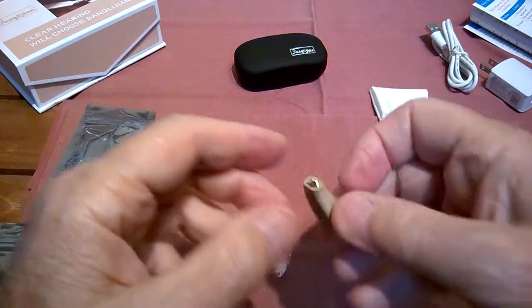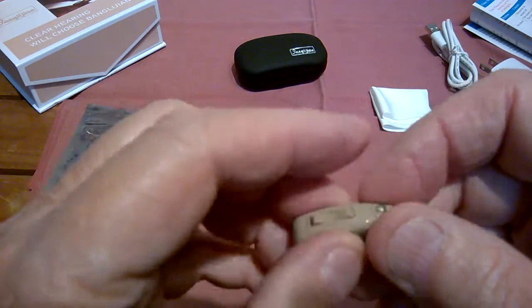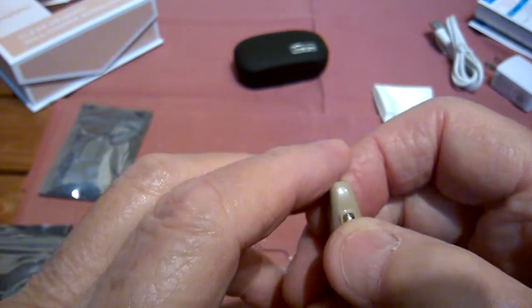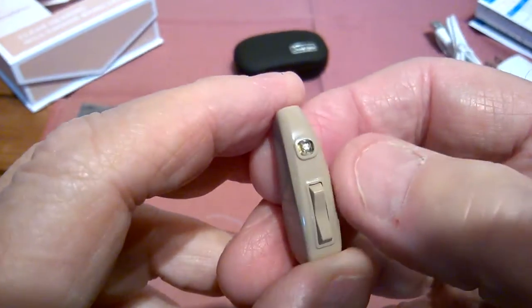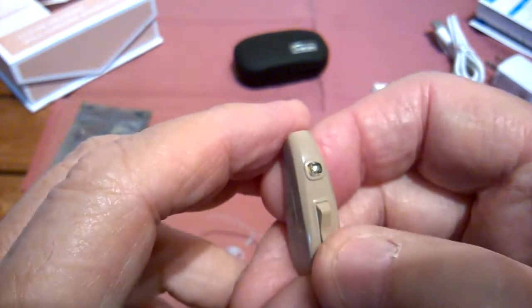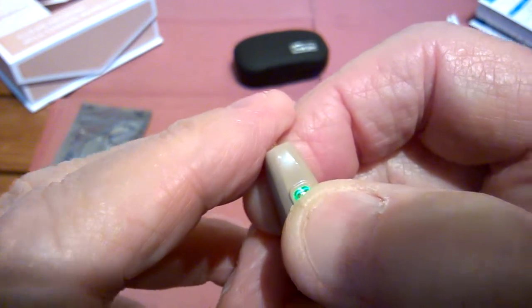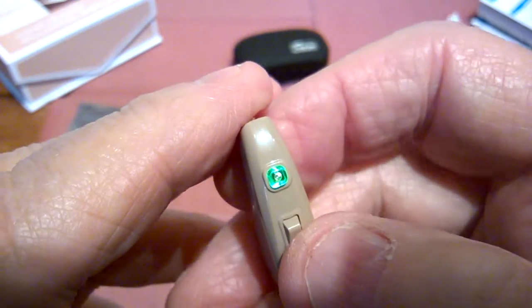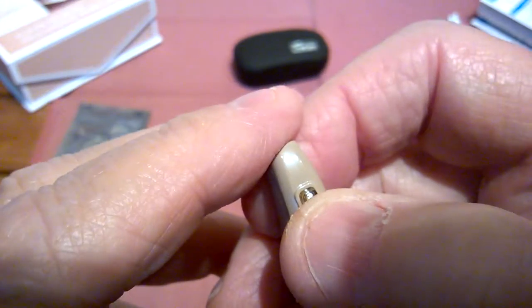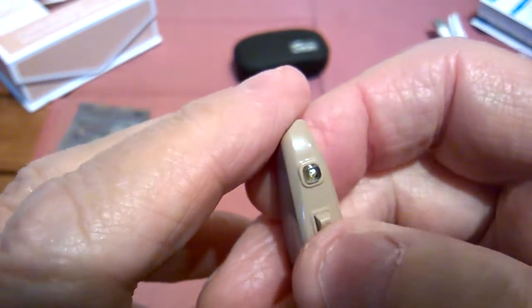So let's get to the hearing aid or the hearing amplifier part. Now, this is the basic unit right here. When you charge them up, when they're fully charged, the top button is a multifunction button. The bottom ones are up and down volume controls. So if you push half of that, you can see it's green. That means it's fully charged because I just charged it. This turns it off. See the blue light? If you do that, it'll turn them off.